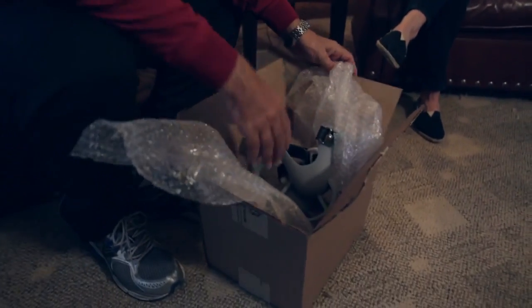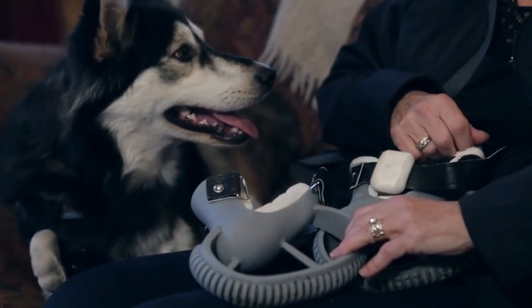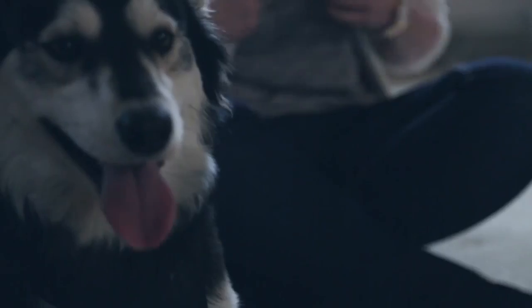Hey Derb, you got your new legs. We started them off very low so that it wouldn't be too drastic. We have a line called the Projet 5500 which enables us to run dual materials, and that has really been key with designing his prosthetics.